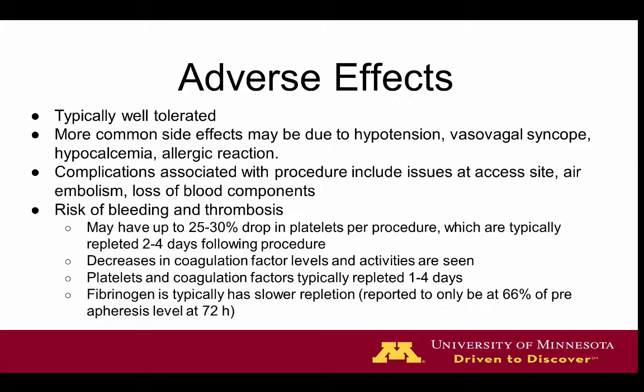So as I mentioned, apheresis is typically well tolerated. The most common side effects may be associated with that citrate infusion of the hypocalcemia. However, the patient may also have some symptoms of hypotension, vasovagal syncope, some allergic reaction as the blood flows through the plastic tubing and plastic instruments, but typically generally very mild and well tolerated.